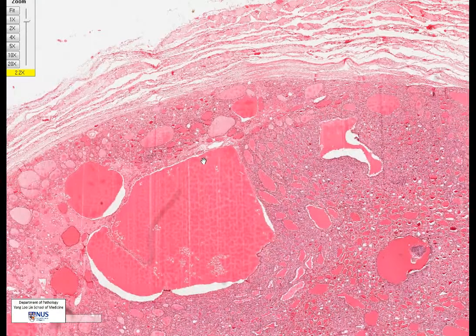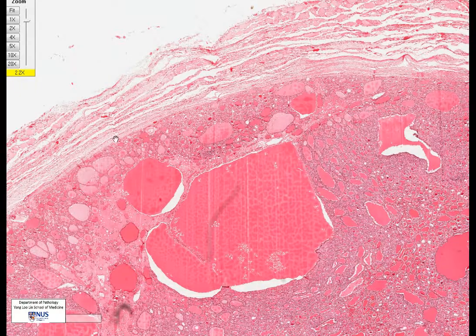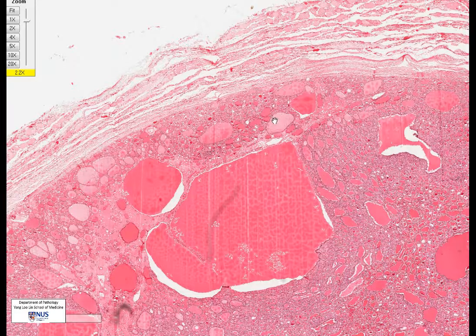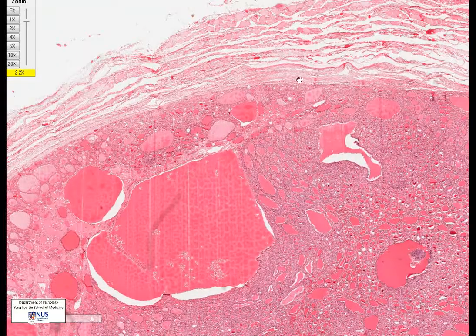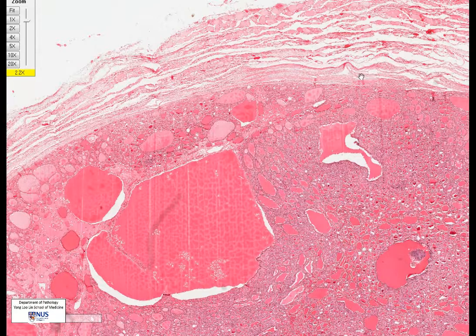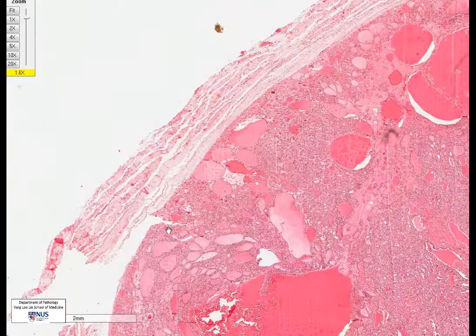Now that we've decided this is neoplastic, we have to decide whether this is a follicular adenoma — which is benign and completely encapsulated — or a follicular carcinoma, where we should be seeing either capsular invasion or vascular invasion. We look for vessels within the capsule or just outside the capsule. Let's take it one by one and have a careful look at the capsule.